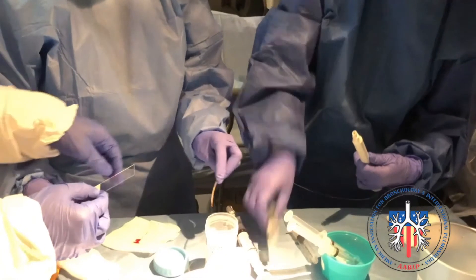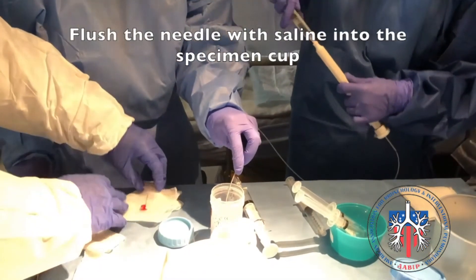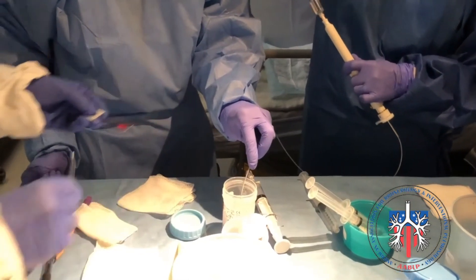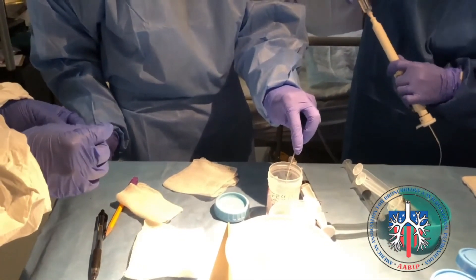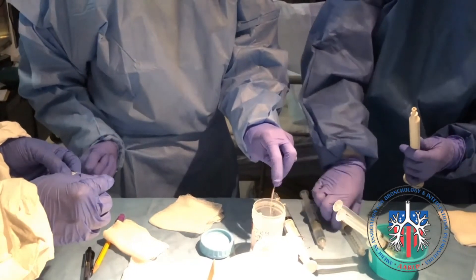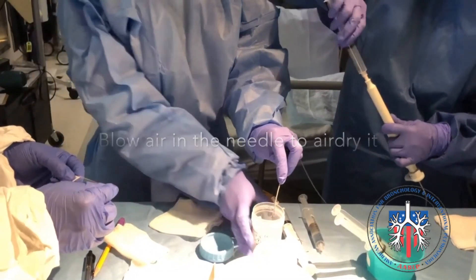Once that is done, you would use a different syringe which contains some saline to flush the leftover material into the specimen container. This is then followed by another blow of air to air-dry the needle to prepare for the next sampling in the node.